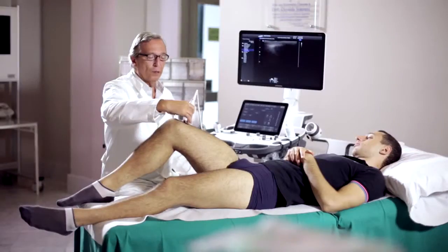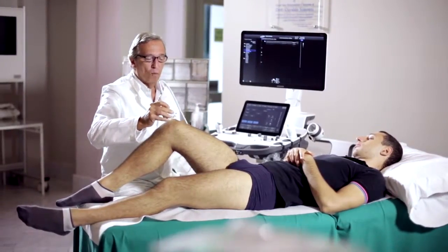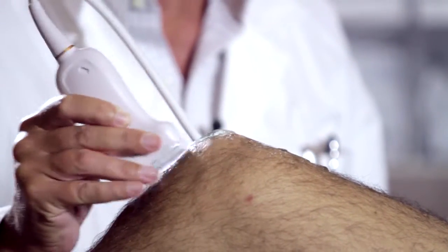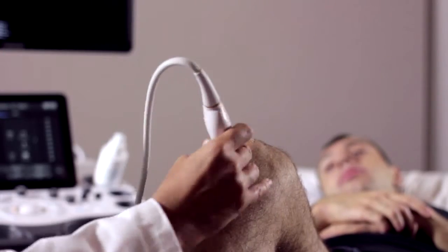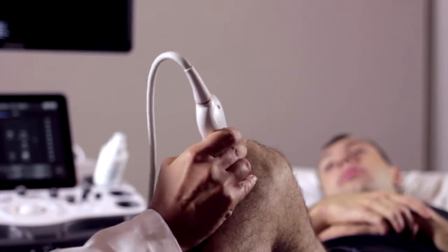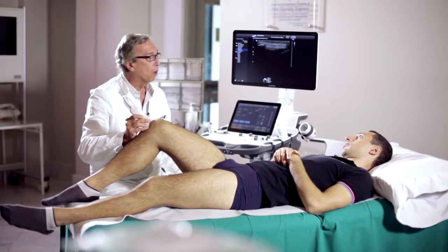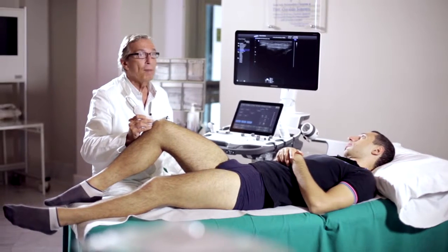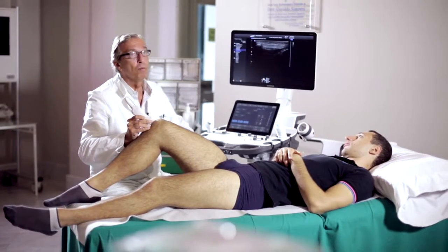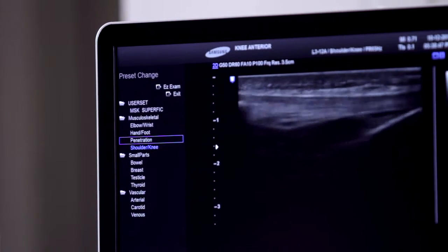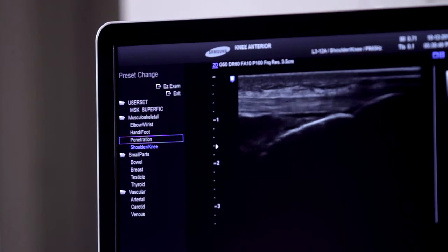Once this is done, we can move to analyze the tendinous component of the rotula with a scan along the major axis of this tendon. We scan it starting from the lower pole of the rotula on the left and move up to its insertion at the distal end of the anterior tibial apophysis.